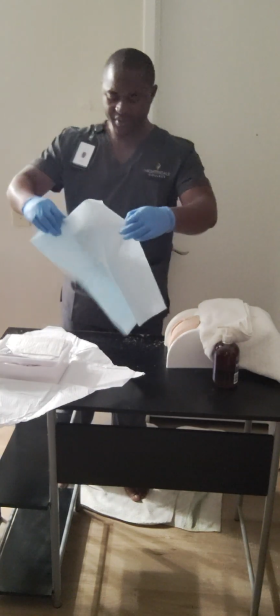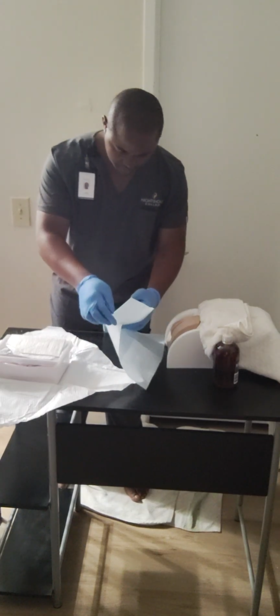Here's my blue drape, shiny side facing down. I'm going to move this kit a little bit to the side, maintaining sterility.